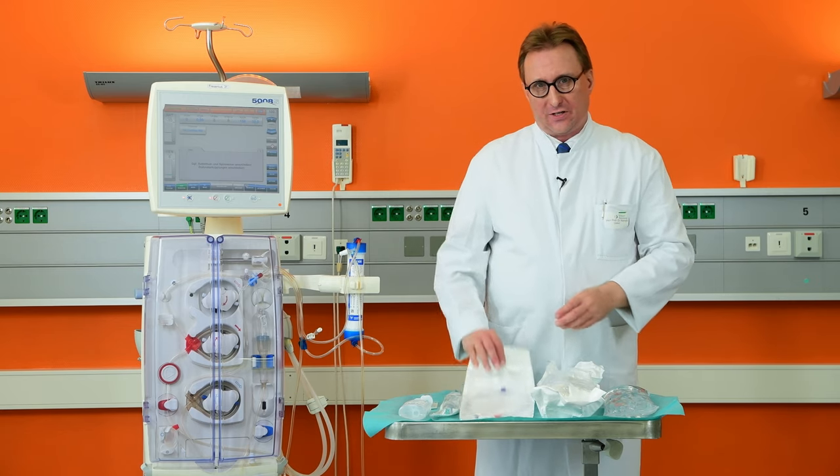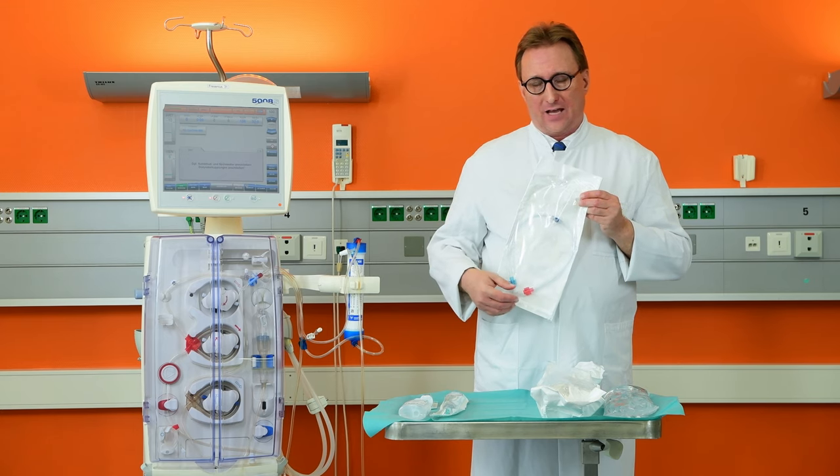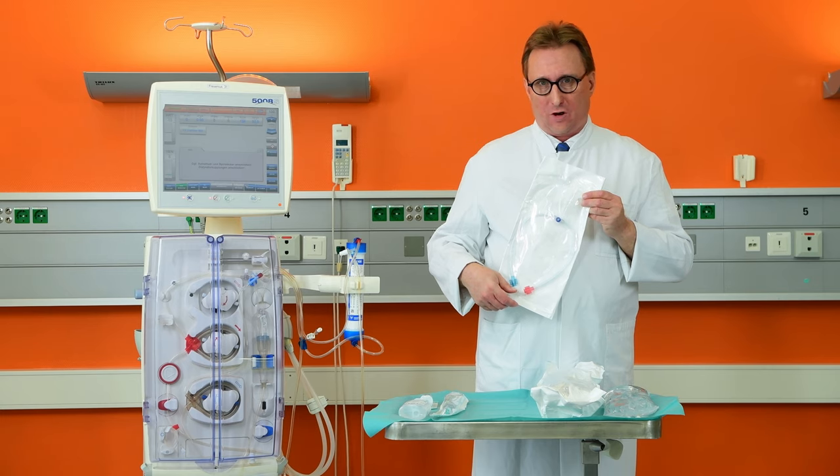With the filter comes a blood tubing that connects the filter to the dialysis circuit, and this one also has an access port to draw blood.